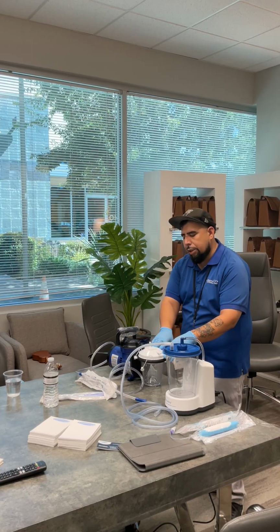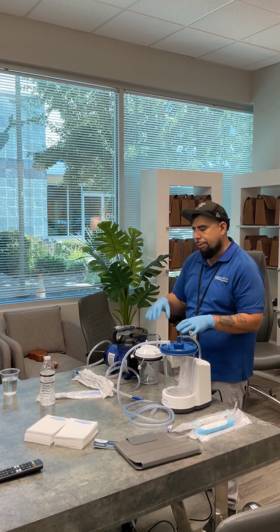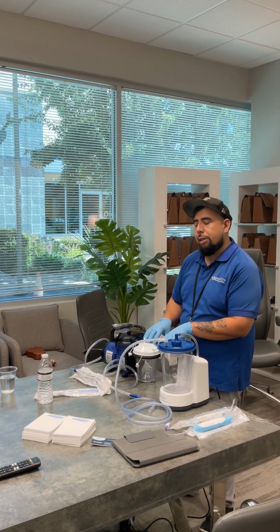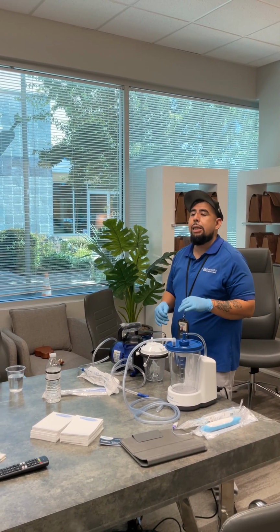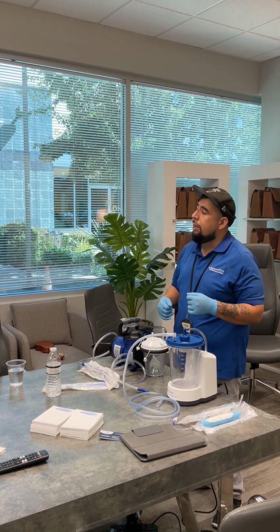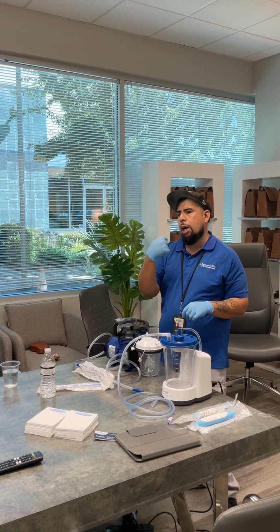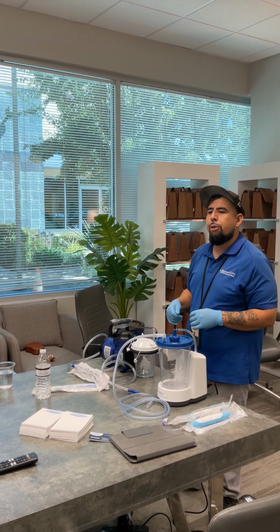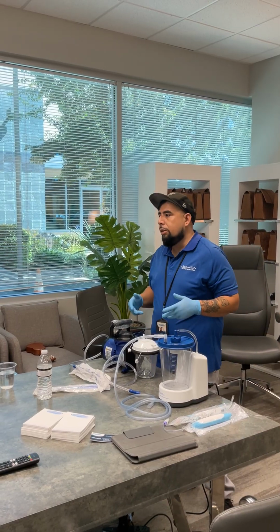It's also a good idea to have a little bit of soapy water here at the bottom, so if any sticky material gets suctioned in there, it's easier to get it out. I also recommend that if the family's having trouble getting any foreign material from the oral cavity, to use a sponge on a stick with some lukewarm water and swab the mouth, and it'll make it a little bit easier to remove any foreign material. Any questions?